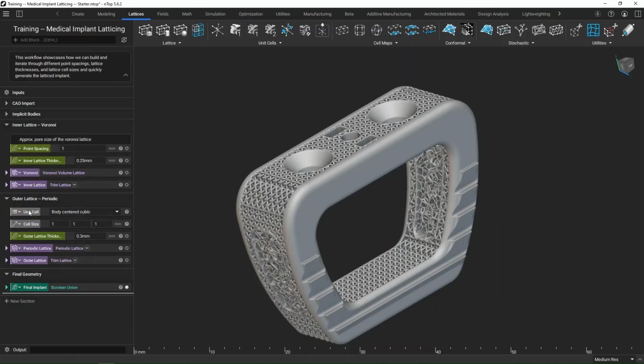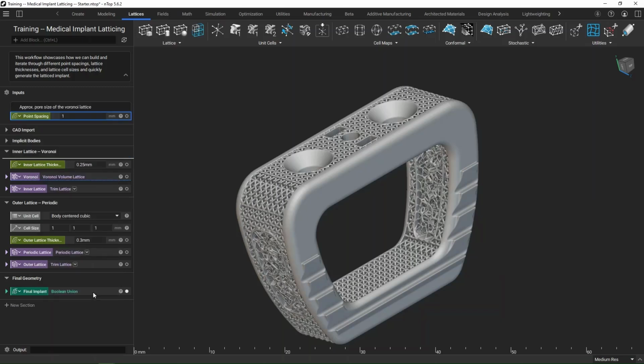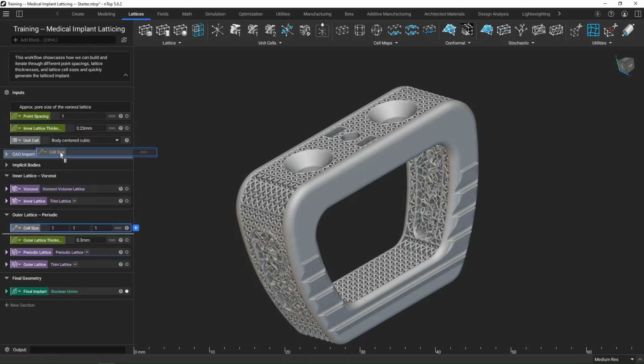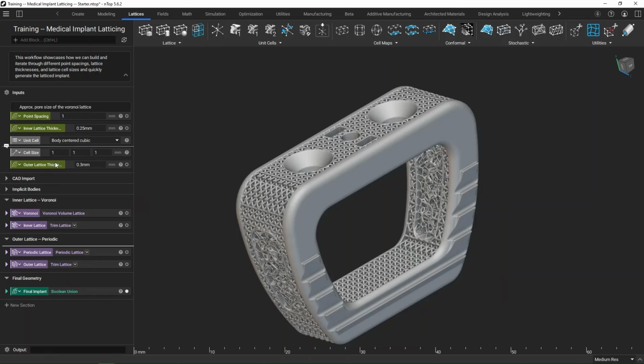I have 5 inputs that I've made into variables. So what I can do is I can right click, make notebook input, and it pops right into those inputs right there. But everything's also collapsed, so just as easy for me to go ahead and drag these up here. So what we're doing, again, is taking this entire workflow and turning it into a single block. And so these are the 5 different parameters that I want to play around with, right? The point spacing of that Voronoi lattice, the thickness of both the inner and the outer lattice, that unit cell, the cell size of the periodic lattice.